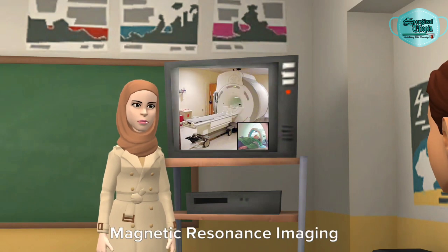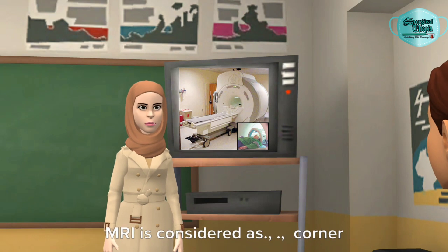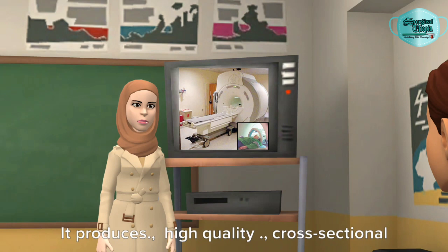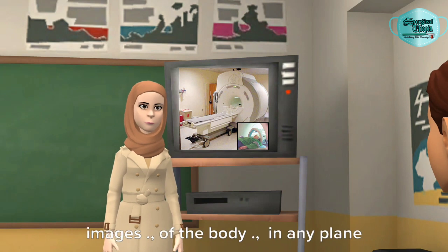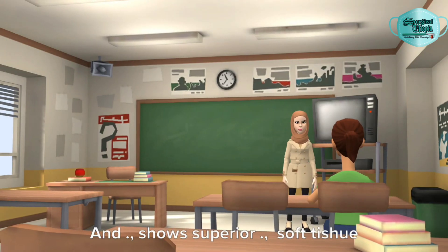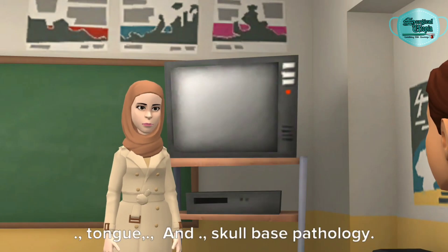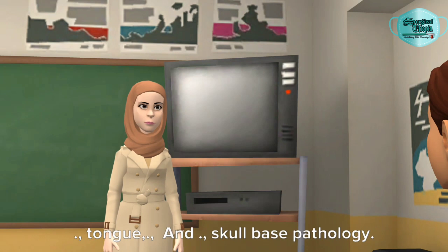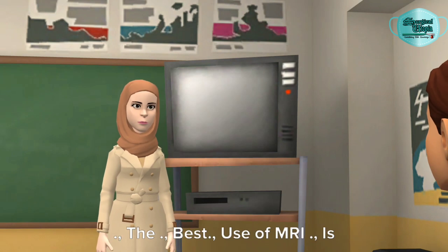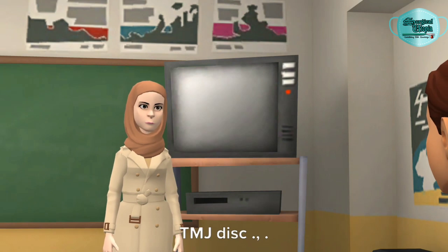Magnetic resonance imaging is the most innovative non-invasive technique and is considered the cornerstone of medical imaging. It produces high-quality cross-sectional images of the body in any plane and shows superior soft tissue contrast. It is the imaging choice for nasopharynx, tongue, and skull base pathology. In the field of maxillofacial surgery, the best use of MRI is in the evaluation of TMJ disc deformities.